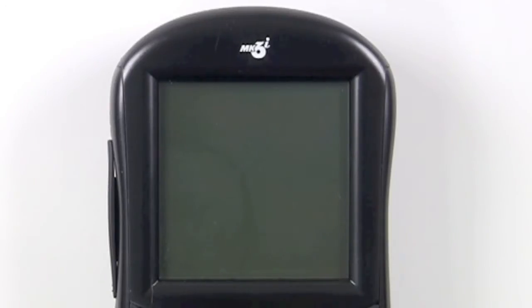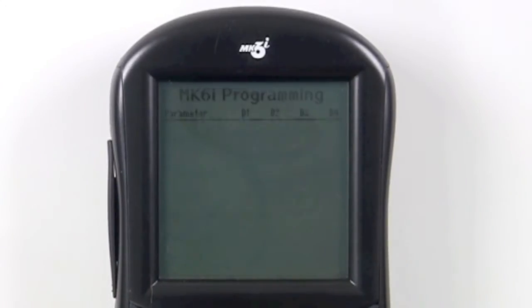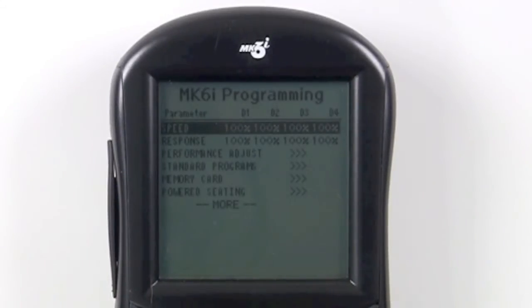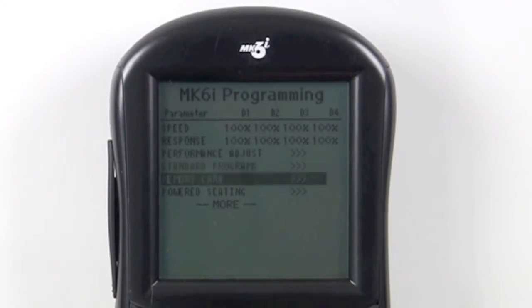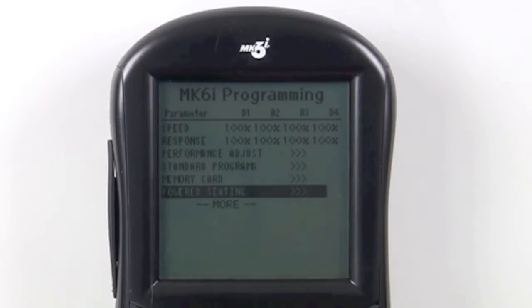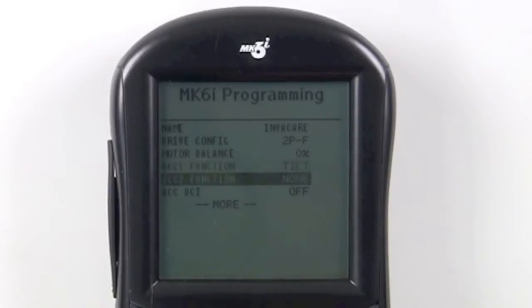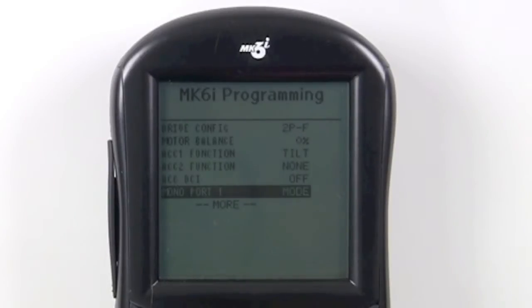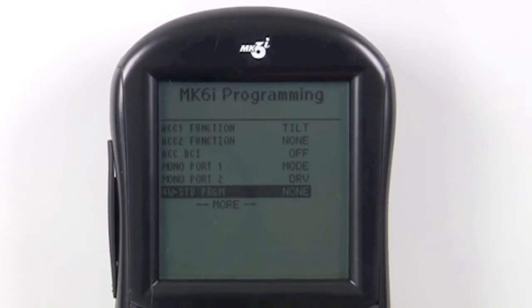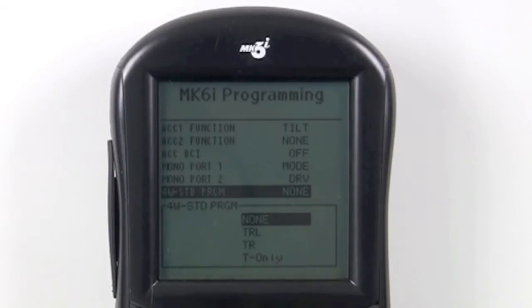Simply plug in the Mark 6 handheld programmer and turn the programmer on. Scroll down to calibration settings and press select. Scroll down to four-way standard program, or 4W standard program, and press select. Then select one of the configurations of the powered seating systems installed on the chair.